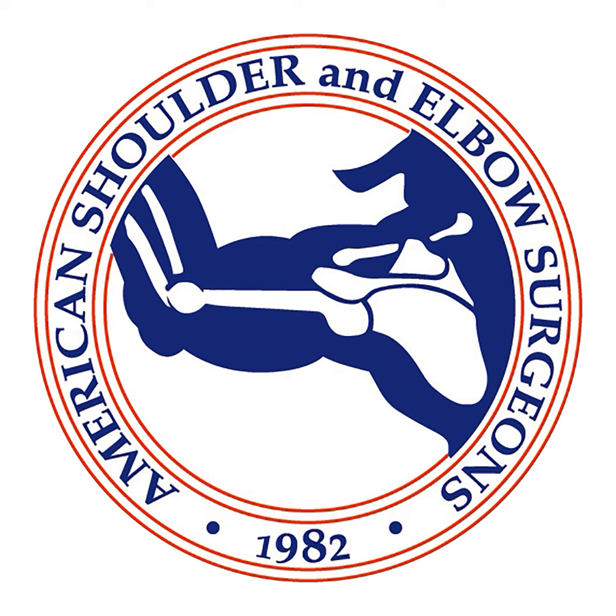But for the surgeon who didn't get trained on stemless, I think there are some advantages to using the stem as a reference, particularly with the cutting guide. For the inexperienced surgeon or somebody who's just starting in stemless, I think using a cutting guide like Dr. Sperling suggested is a good idea. It is tricky to do a freehand cut. I personally do freehand cuts, but for somebody who's new in practice or trying it for the first time, I would probably recommend using the cutting guide, and then you can always take a second cut if you want to adjust it, as John said.